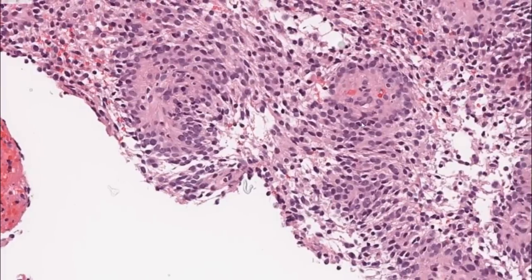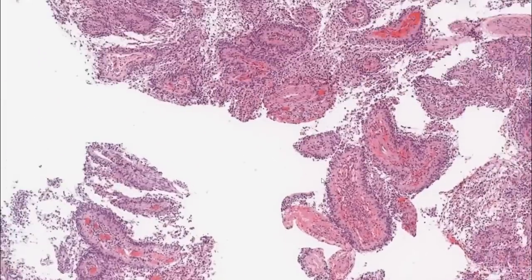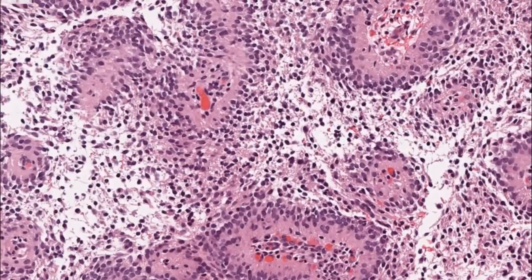You can see here, they are broad cytoplasmic processes of the cells. This is something you see here. Cells look a little plumper. You don't have that fibrillary pattern, actually. You see the same thing here.